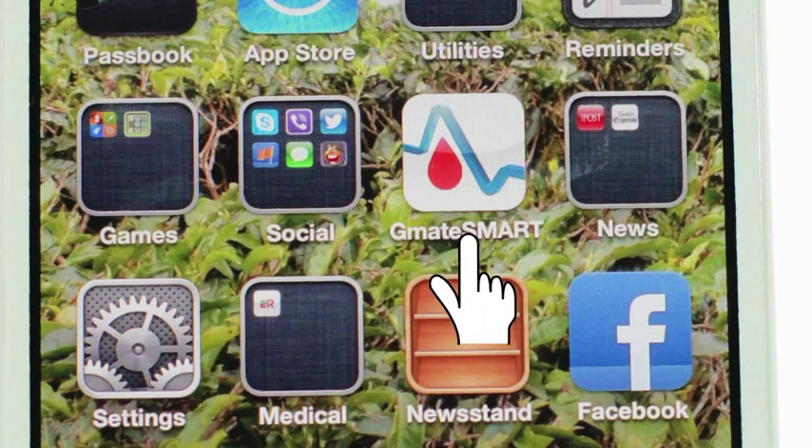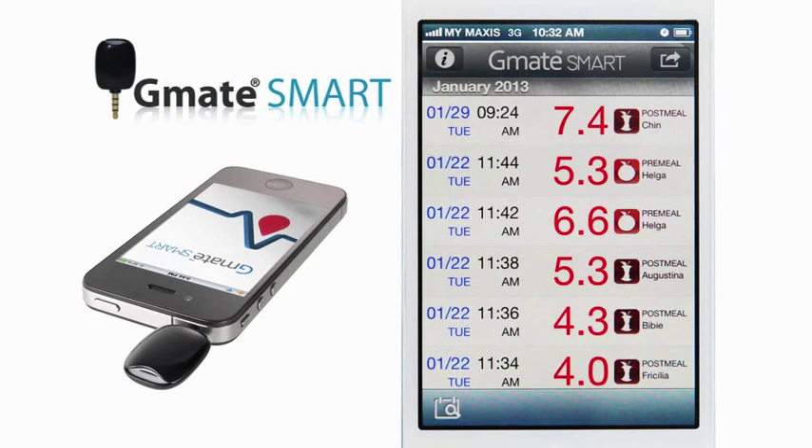Touch the G-Mate Smart application icon on your smartphone. The test results will display as a list. The most recently measured result is displayed at the top of the screen.